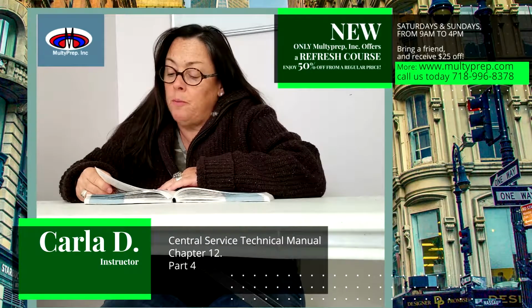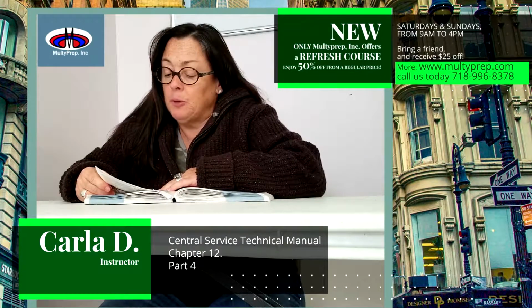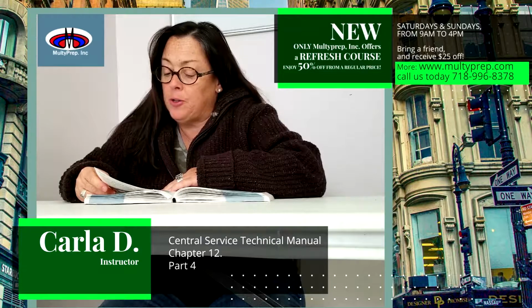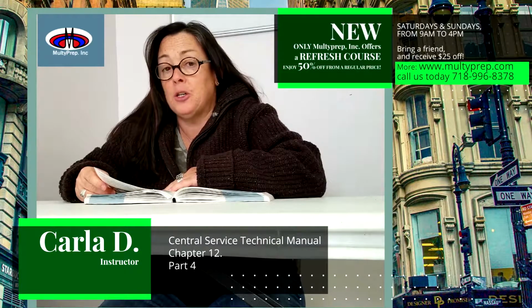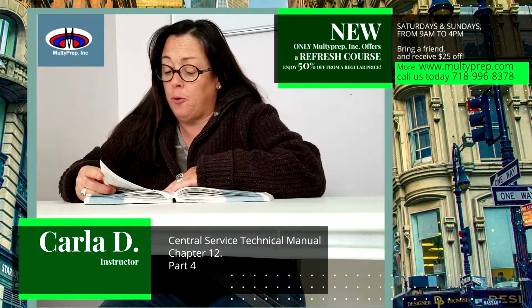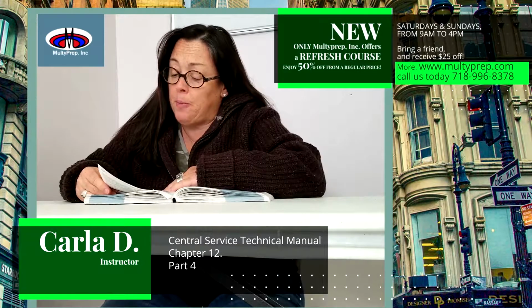Important note, be aware of packaging expiration dates. Some disposable packaging materials contain expiration dates from the manufacturer. It is important to check for an expiration date prior to using any disposable packaging material, since the expiration date usually indicates a decrease in the packaging's ability to perform at optimal standards, including microbial barrier properties.